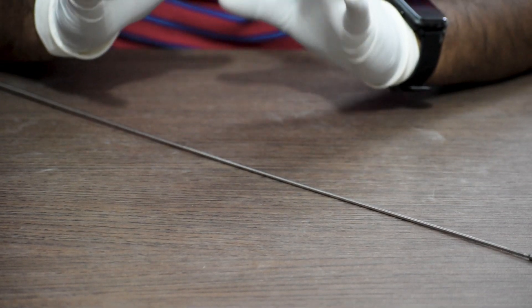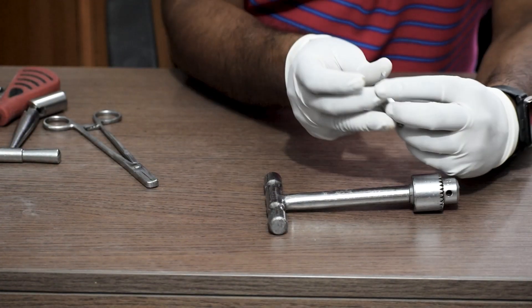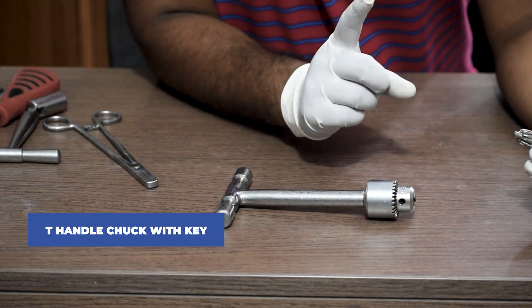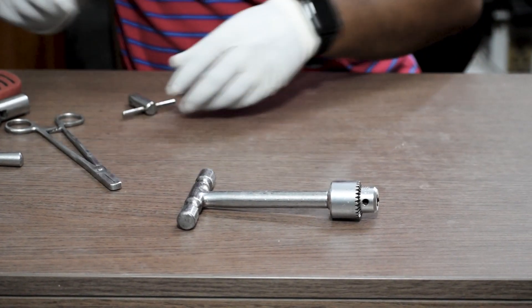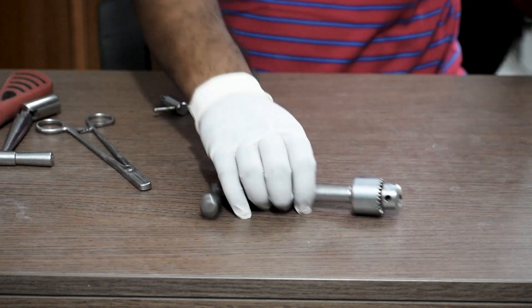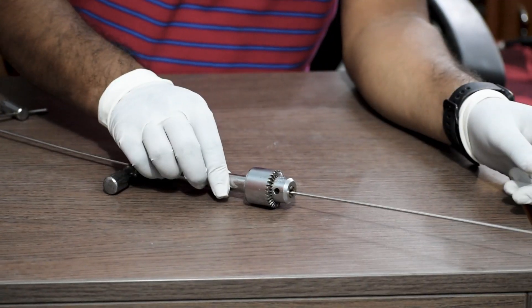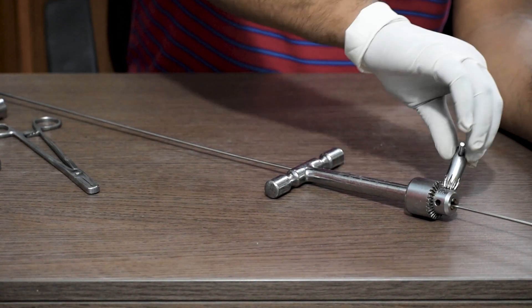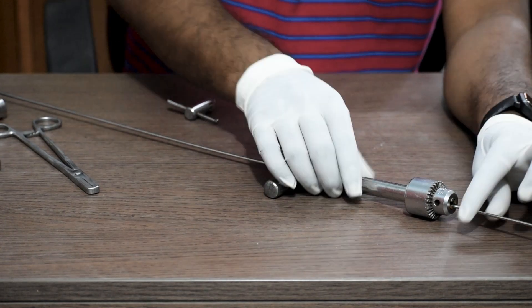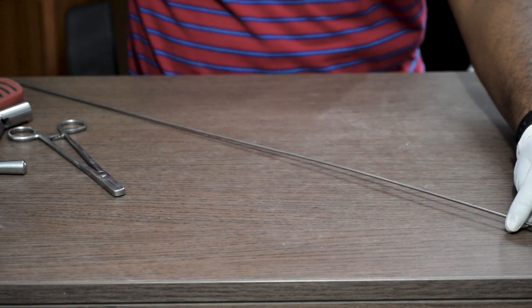After the entry point is created, we will insert the beaded guide wire or olive guide wire inside the canal. To do that, we will use a T-handle chuck with key to hold the guide wire properly and push it in. Once the T-handle is inserted on the guide wire, we will tighten the chuck and key, lock it, push the guide wire in, and then remove the T-handle chuck.